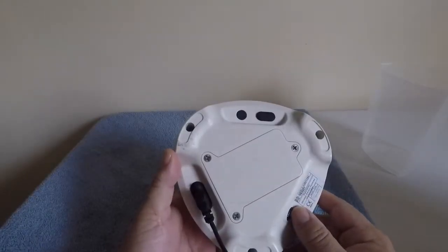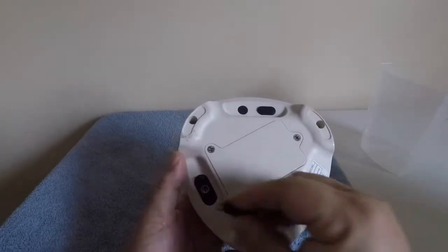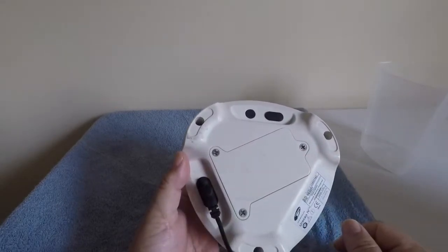Let's take a look at the underside of the Urocap. Right here we have the power connection for our power cable, and right here we have our battery compartment.